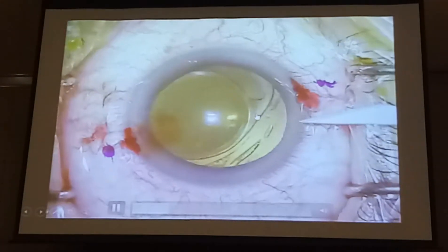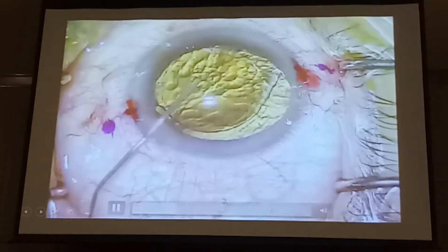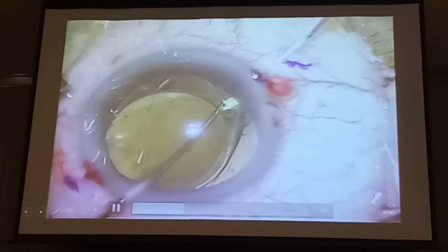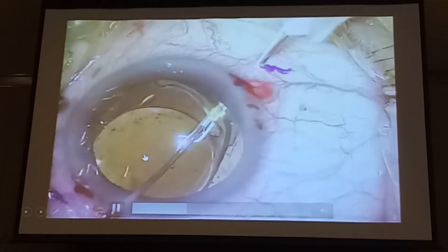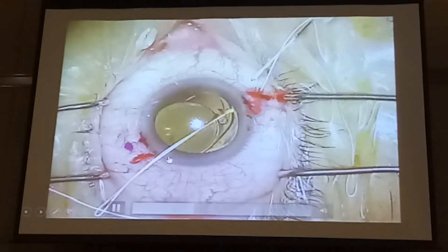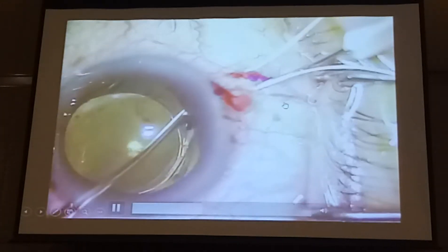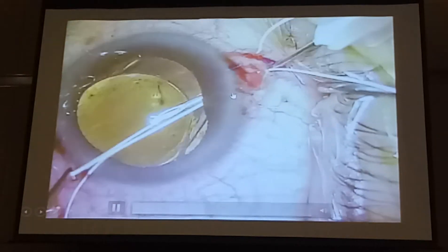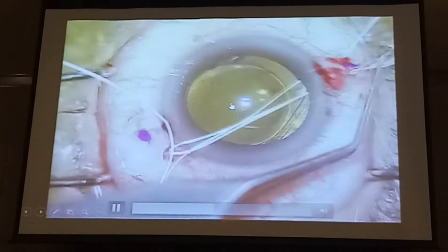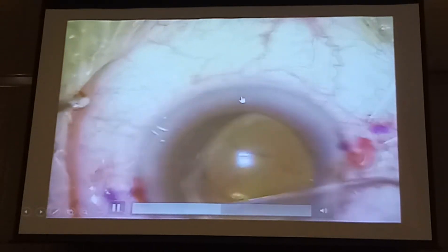This is a single-piece lens and it's difficult to suture, but it can be done if it is found within the capsular bag. So I'm going to use my suture snare technique. Because this part of the capsular bag is attached at present but may become loose, I've decided I'm going to fix both points. This patient has retinitis pigmentosa — you may notice the reflex is a bit yellowish. These patients have got loose zonules and this is a progressive disease; although this looks fine, I'm going to suture it.